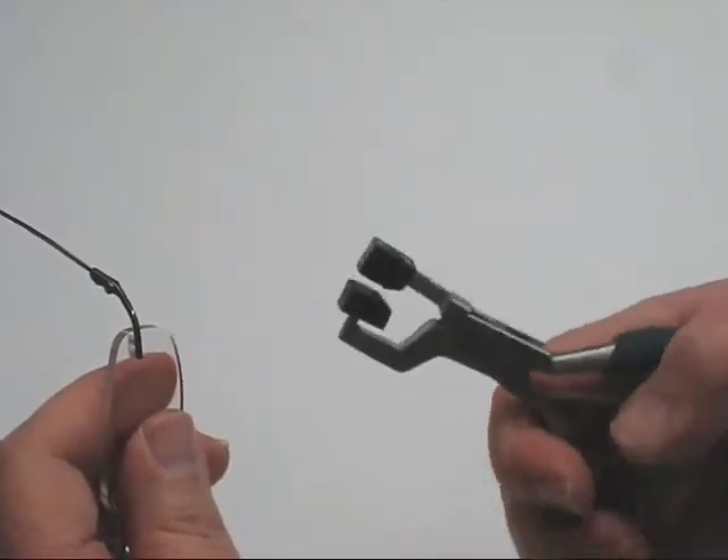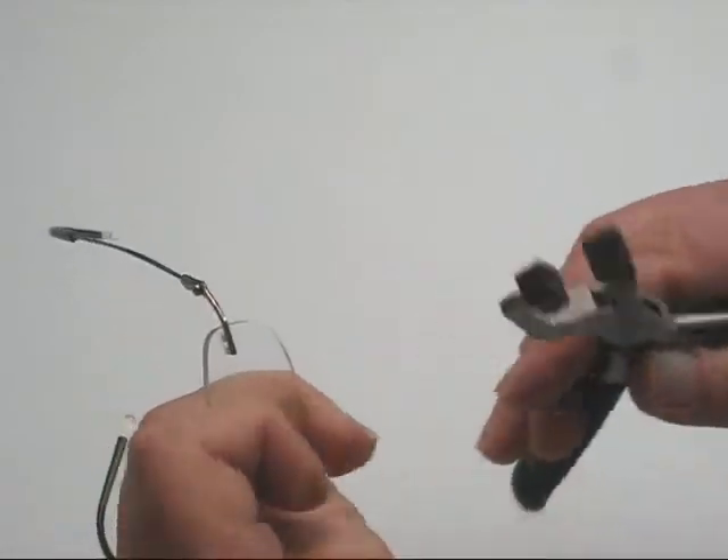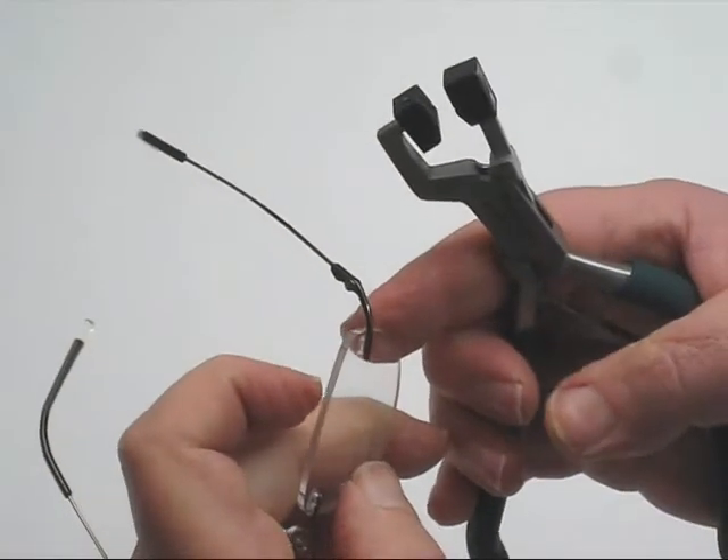In the dispensing version of the compression tool, the bottom jaw actually pivots, so it compensates for the back side curve.